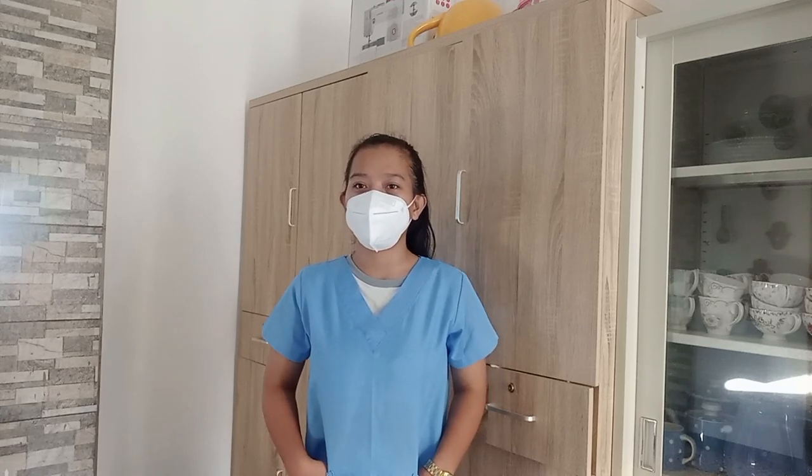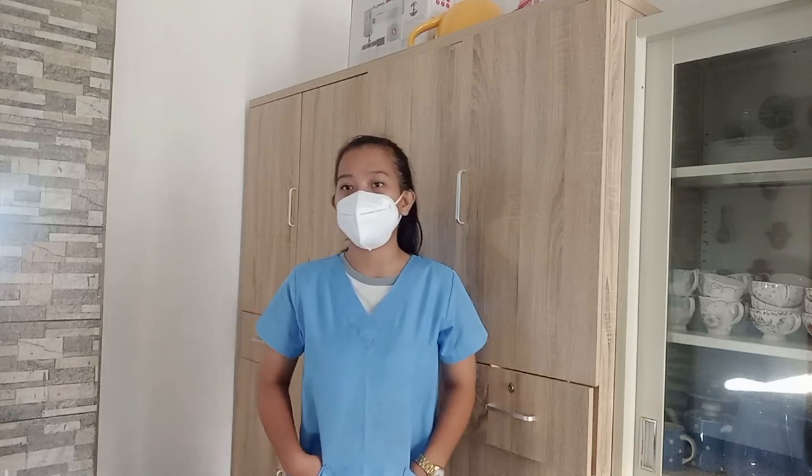Tell the patient to report any feelings of dizziness, weakness, or shortness of breath while walking. Decide how far to walk. Lastly, encourage the patient to make use of the Stand Assist device if available. Assist the patient to stand and direct them to face forward in the tripod position.